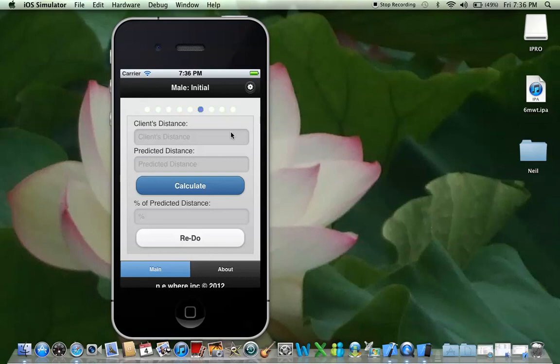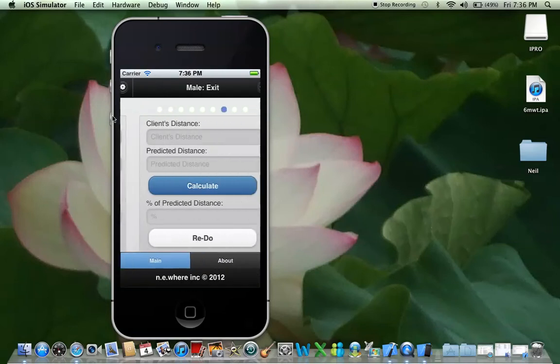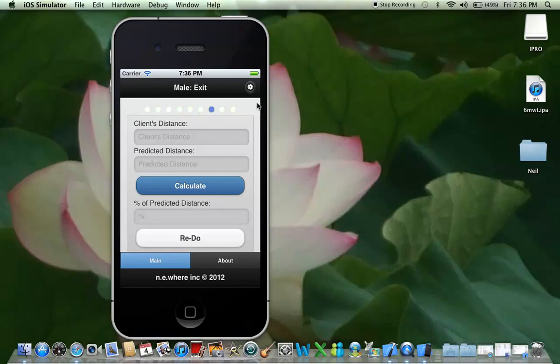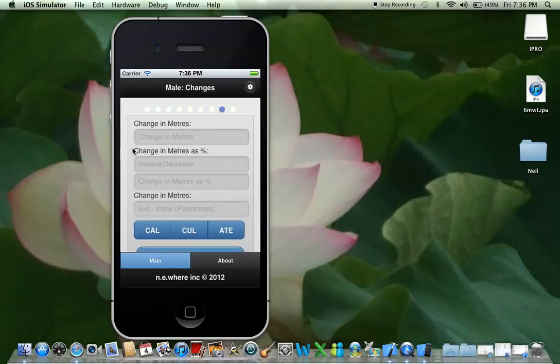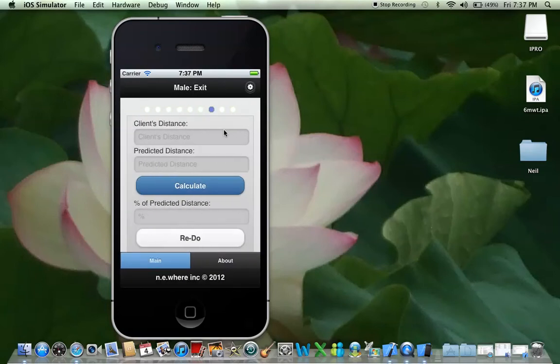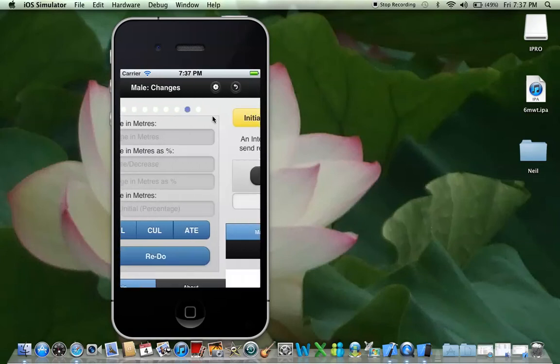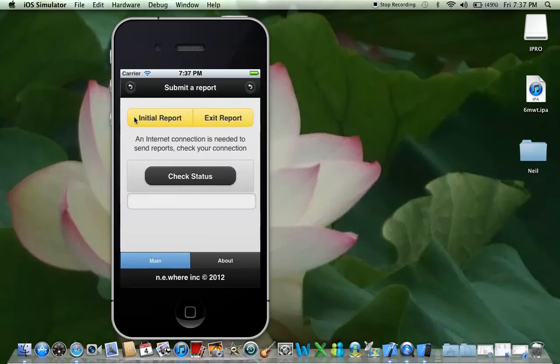This is the client distance page. Once you've added everything and transferred to the initial assessment, the values appear here. Then you press calculate and you'll have your percentage of the predicted distance. Since it's a male client doing his initial assessment, we don't need to do anything else other than submit the report. We can skip through the male exit assessment and skip through the changes — you'd only use those at an exit assessment.